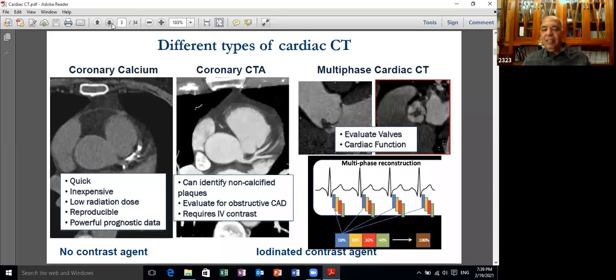So the story of cardiac CT actually started back in 1967. A British engineer, Godfrey Hounsfield, noticed that if you image the human body from different angles and get multiple shots from these different angles, then you can get considerable variable attenuation of the X-ray beams penetrating the human torso. And this will allow minute differentiation between various organs and various tissues.